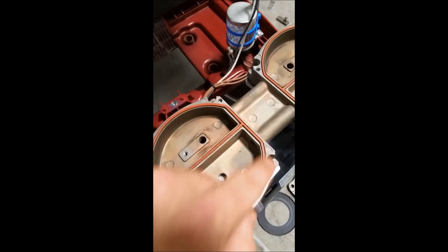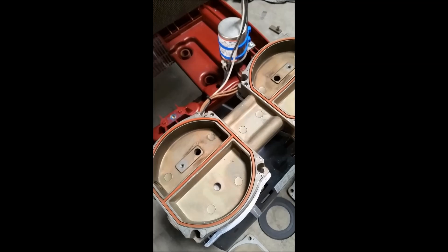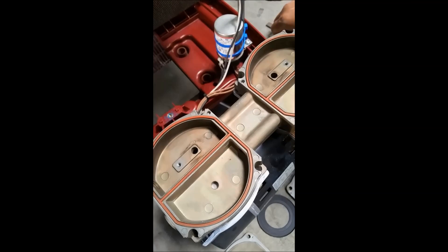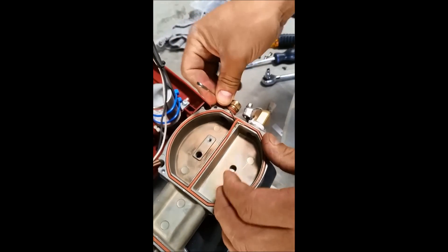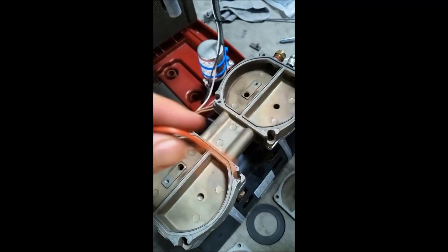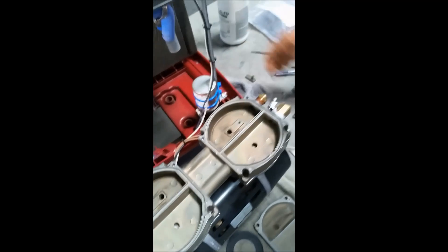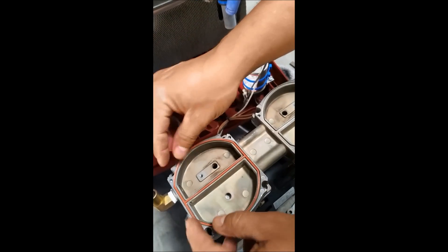Here's where the seals are that we're going to replace this time. You can get a flathead screwdriver or just a pin and pull them out — as before, we're not concerned with tearing these. You can see what these look like: they're dingy, certainly frayed here and here, so these would be an issue in short order. We're going to clean around the area that we just removed, then place our new seals.